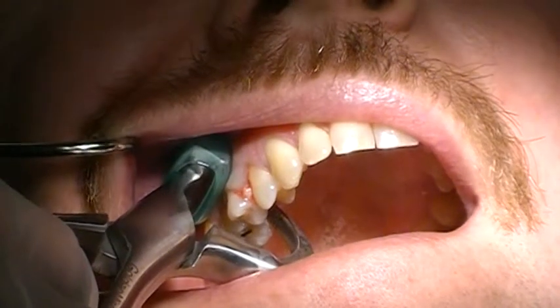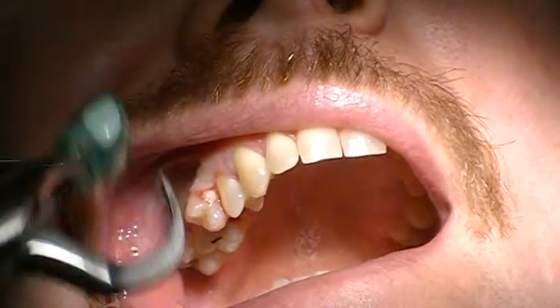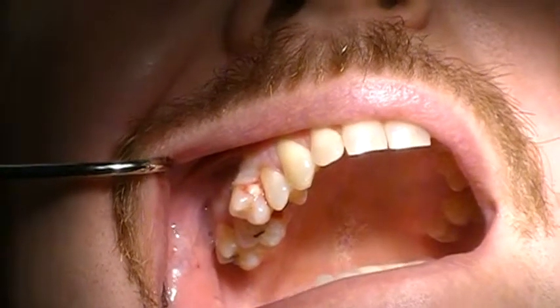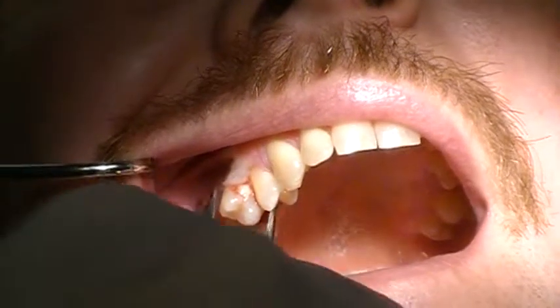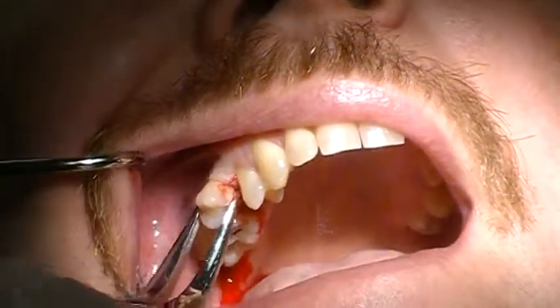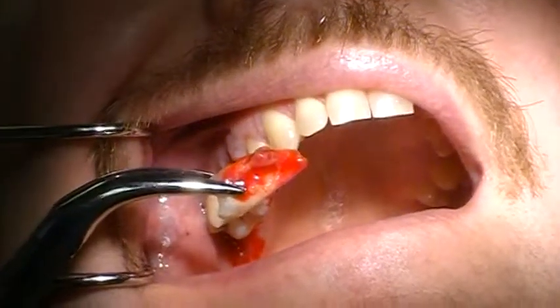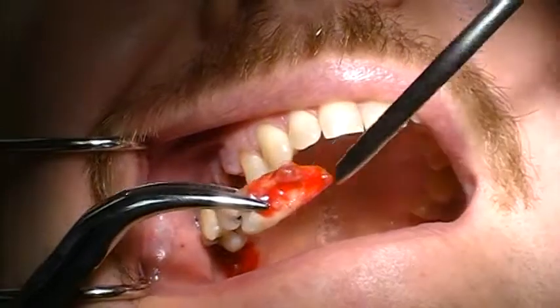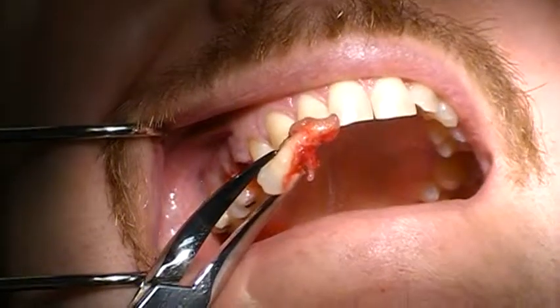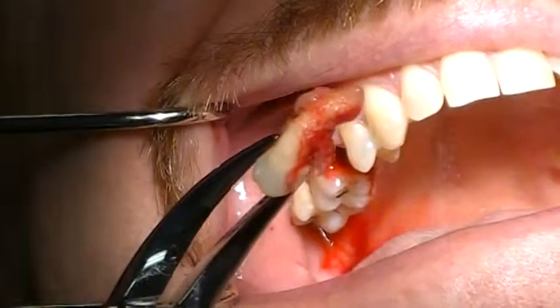Slowly — and you saw that little pop. I'm just going to take another forcep and simply remove the tooth and the infection. You can see the infection, you can see the fracture, and we got the root out in one piece. It's amazing — it's magical.